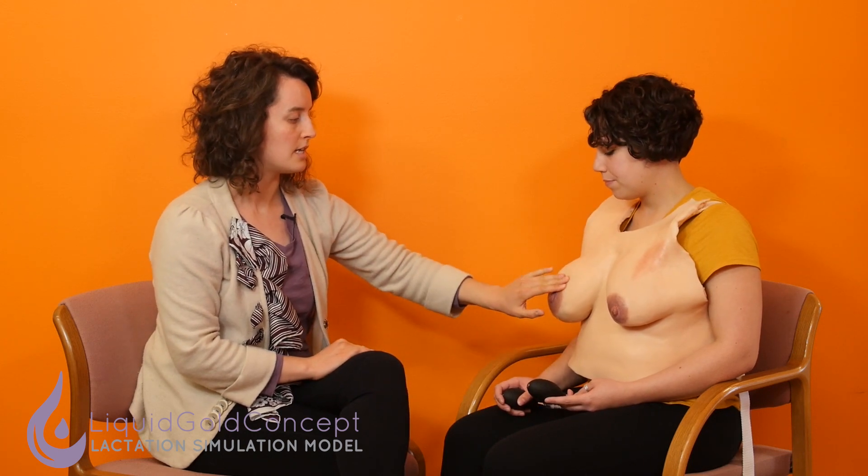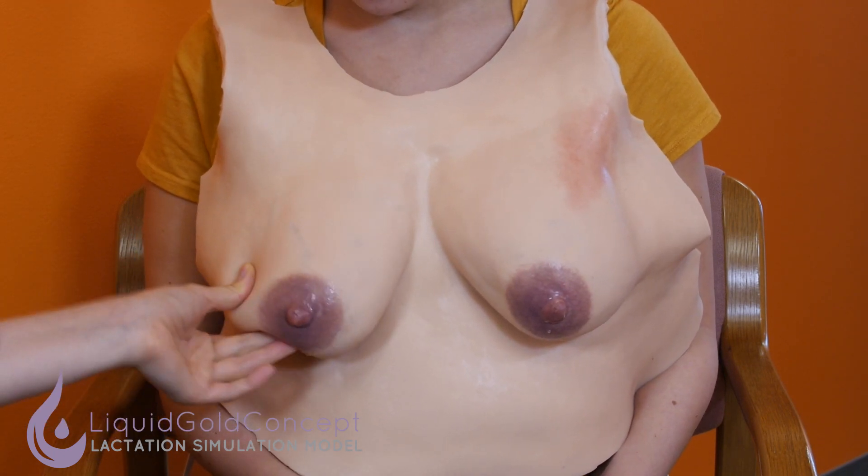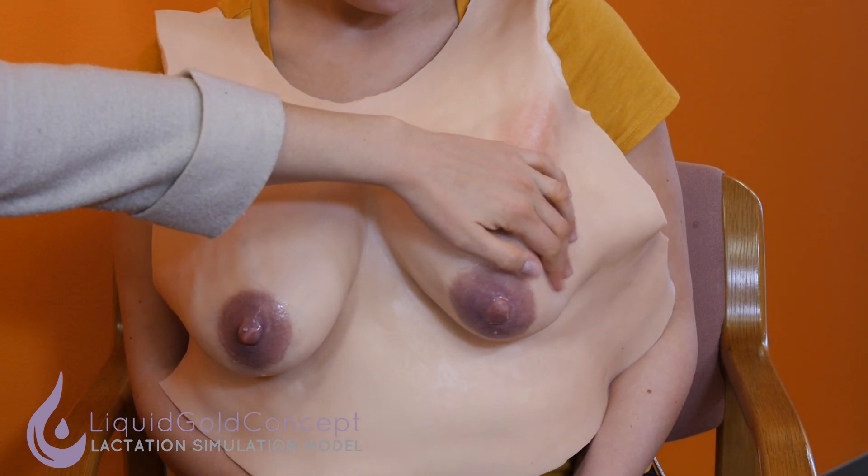All of our LSMs are compatible with electric and manual breast pumps. Inside the LSM you can actually feel some plugged ducts — we have some sub-areolar plugged ducts that you can feel, and then in the tail of Spence we have another plugged duct. This Essential LSM is really ideal for the basics of breastfeeding training, whether you have patients who are ready to deliver, community health workers, beginning nursing students, or medical students, to get them comfortable with the basics of breastfeeding, latch, and hand expression.